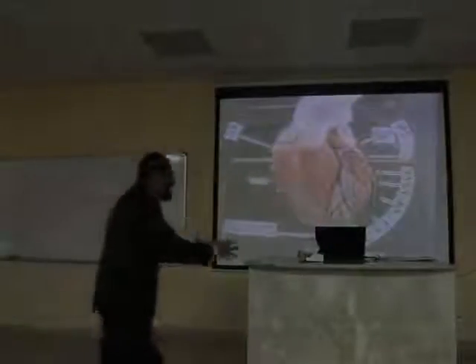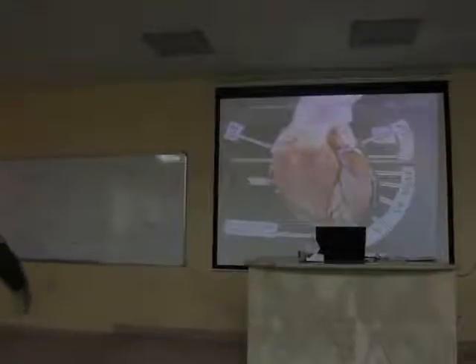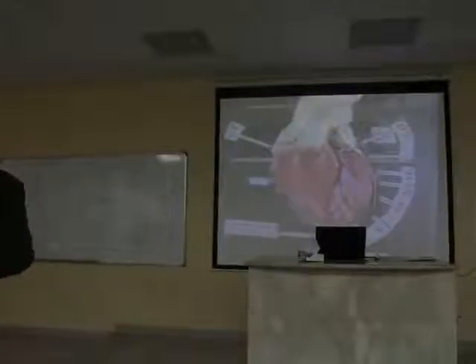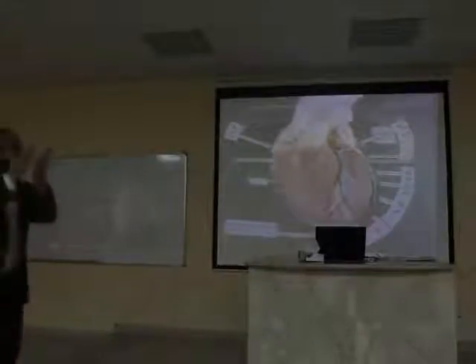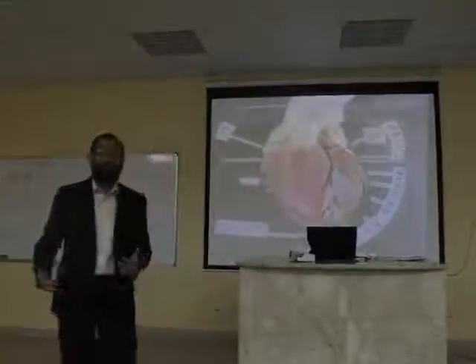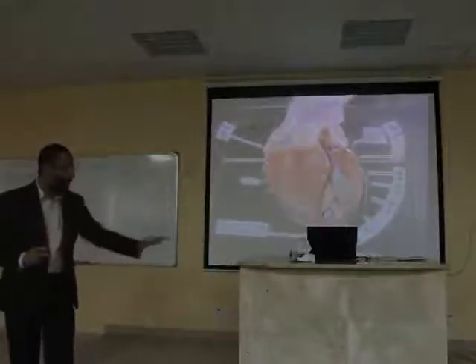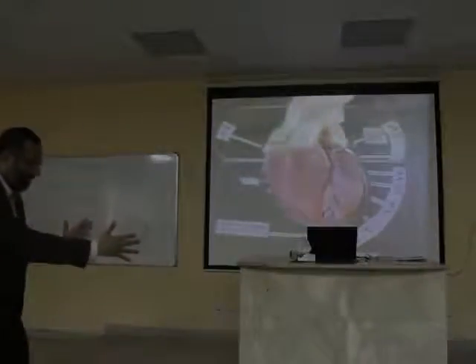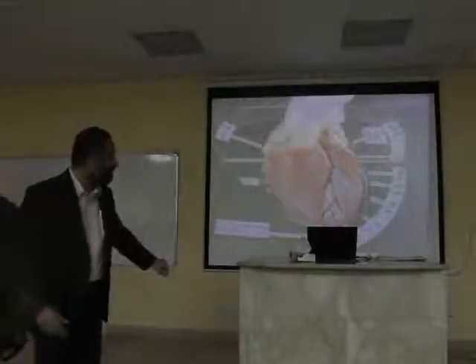I will record the activity of the interventricular septum from inside. So V1 and V2, what are they recording? The electrical activity mainly of the interventricular septum. Are you comfortable with the septum? You know, the partition. It's a thick muscular wall, and in many diseases the wall is damaged, as in myocardial infarction. So if you want to check the electrical activity and function of the septum, which leads are the best? V1 and V2. They look from this angle and the front, but mainly they are recording the septum. V1, V2 for septum.